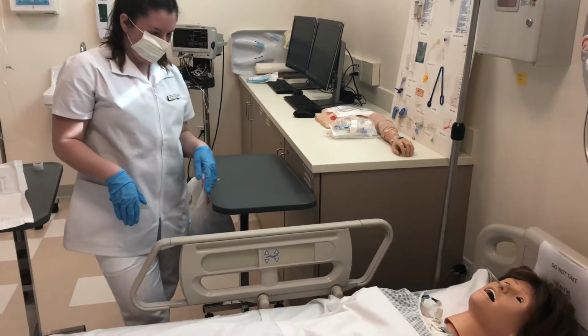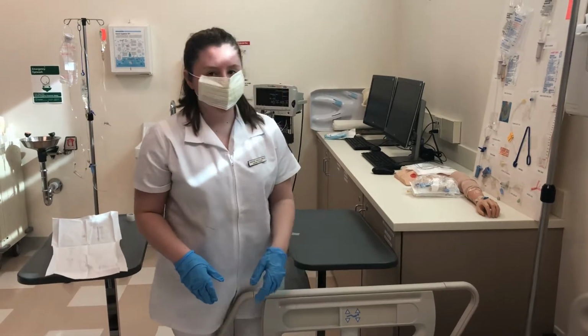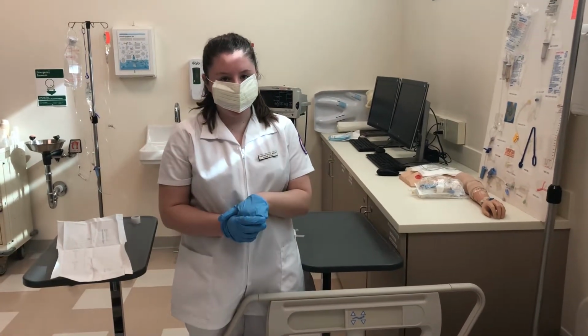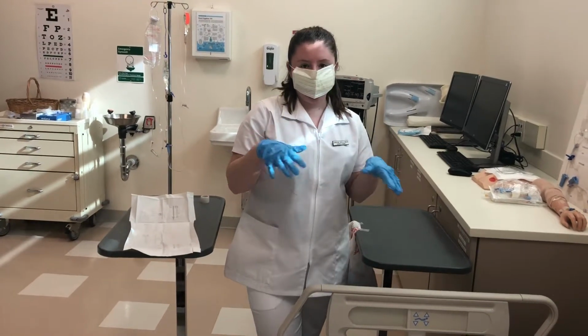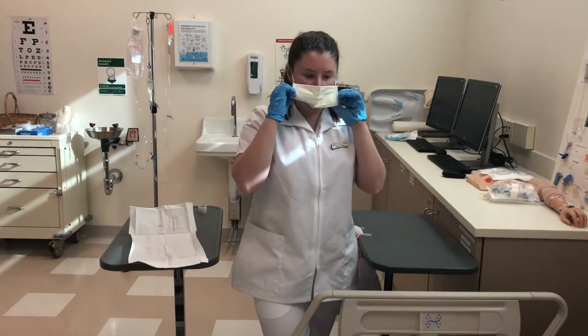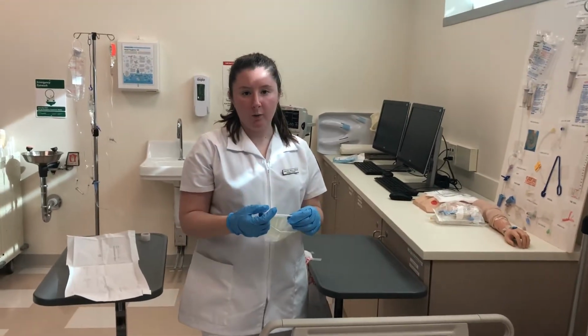So the patient is in their lowest position. I'm going to make sure that they have their call bell next to them. Before I leave their room, I'm going to make sure if there's anything else I can do for them, I will do for them. And then once I am done here with the patient, I'll take off all of my equipment and I'll discard of it. And then I will go and document what I did.